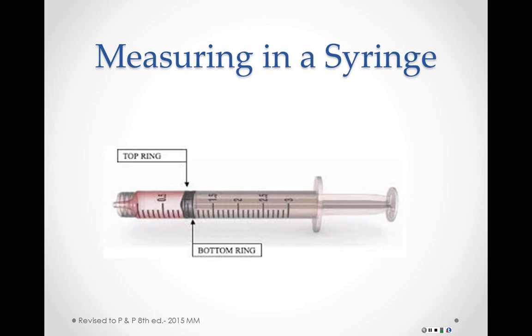A measurement scale is a very important feature of the syringe and can be found along the barrel. The units of measurement are used to prepare the desired injection amount. Syringes are most commonly marked with scales in tenths of a milliliter, but not always. Some are marked by 0.2 of a milliliter. A small TB syringe is marked by hundredths of a milliliter. Insulin syringes are marked in units. Some are marked 1 unit at a time and some 2 units at a time.